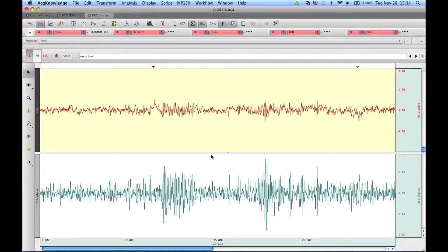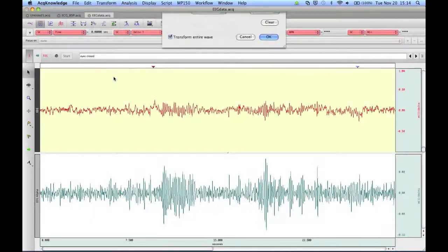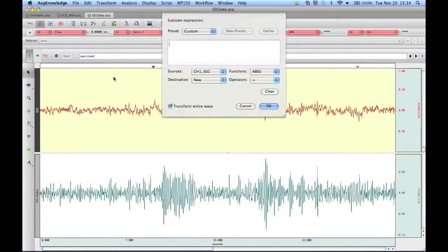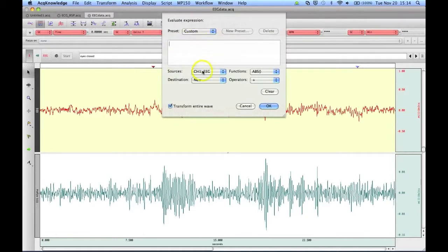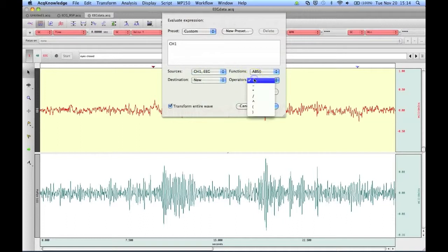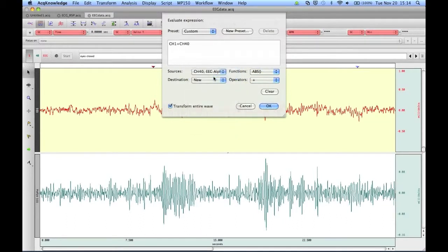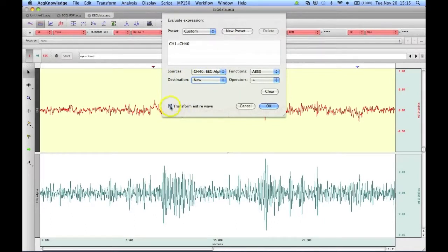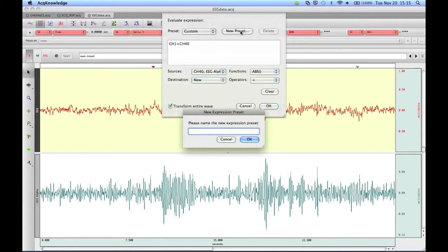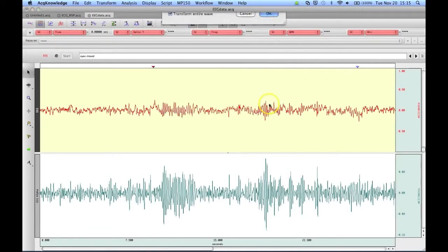The next new preset type is Expression. To create a new Expression preset, we go to the Transform menu, select Expression, and then we begin entering in the expression we'd like to create. So for example, I could say Channel 1 plus Channel 40 and send that into a new destination channel. You can then select either Transform the entire wave or just a selection, and then we can make this into a new preset. And I will call this EEG edition, and click OK, and click OK.